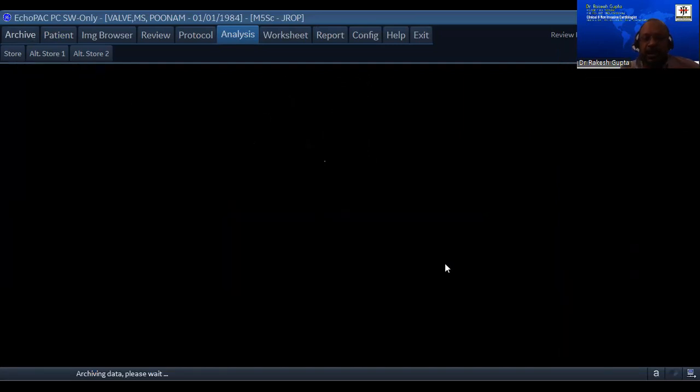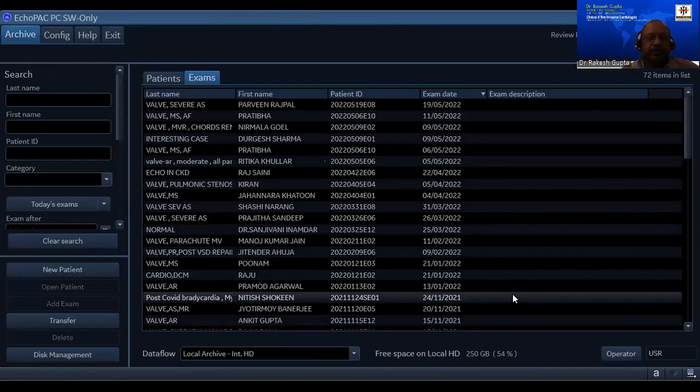So from here, go ahead. So by echo, can we say that the patient has gone through BMV? We can say sometimes. I'm not saying 100%. Sometimes there is a commissural splitting in the report, and we always say that the patient has got a BMV or CMV, so it should be written in the report.